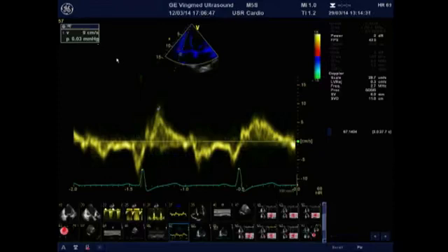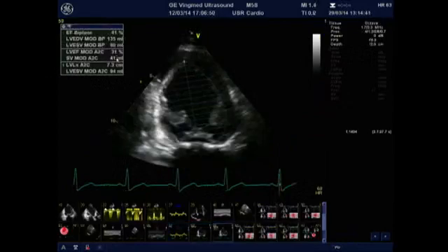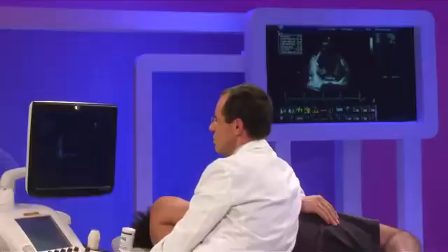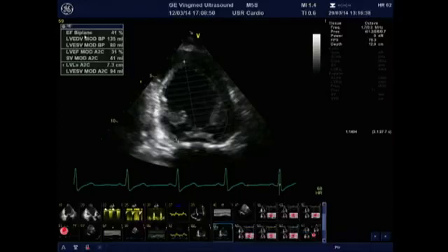And finally, the conventional approach to the systolic left ventricular function shows that the ejection fraction using the Simpson biplane formula is 41%, confirming our eyeball first impression and confirming also the speckle tracking assessment that the myocardial global function was mildly to moderately reduced. So to conclude, I would like to say that this patient is a patient with dilated ischemic cardiomyopathy with mild to moderate depressed systolic function and increased left ventricular filling pressures.